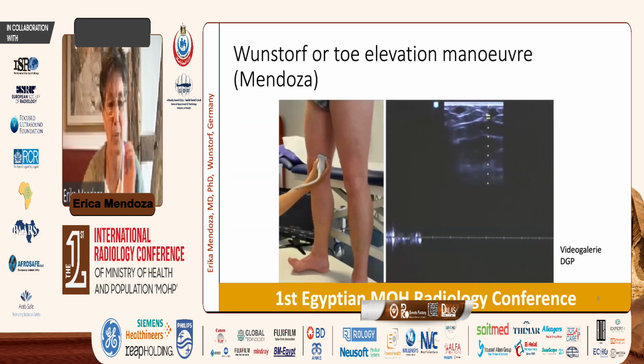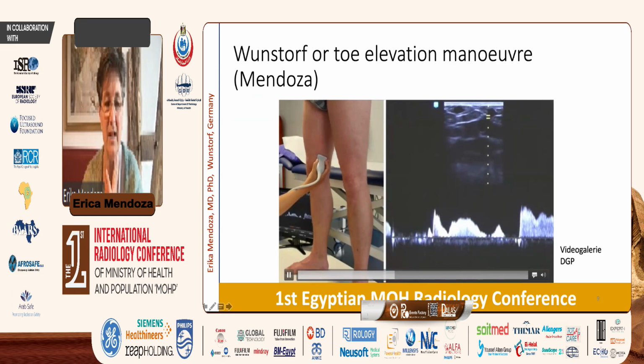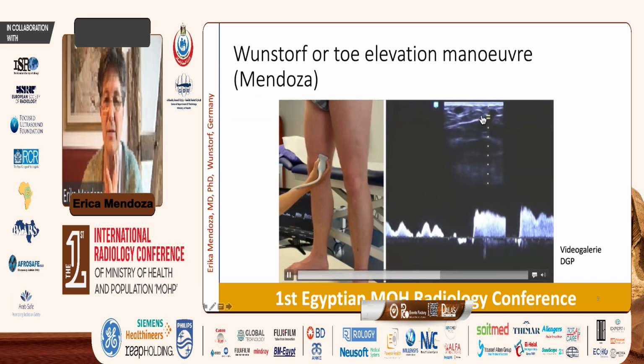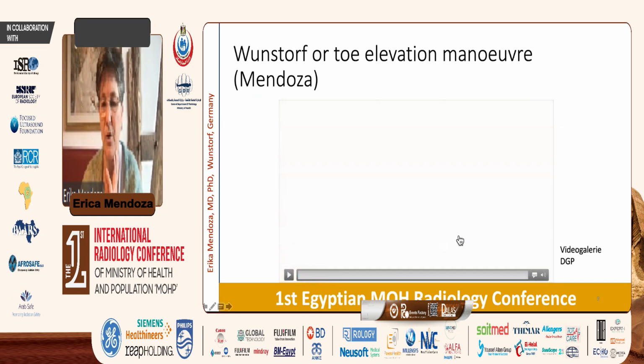This is the person elevating the toe, and you see there is a large reflux. Here again, just pay attention: flow, elevation, and large reflux in the vein. And this is a very good possibility to always have the same flow measurement. This is the place where the side branch exits. And now we go a little bit deeper with the device, and there is no longer a reflux. You see, it is an antegrade flow and no reflux.